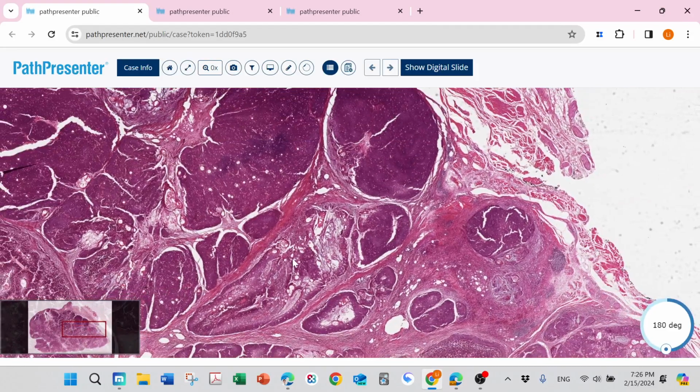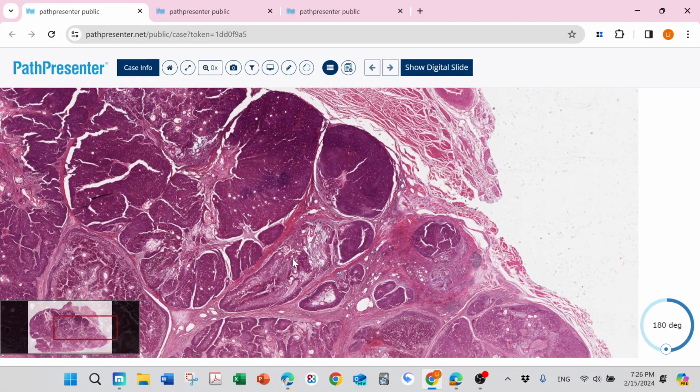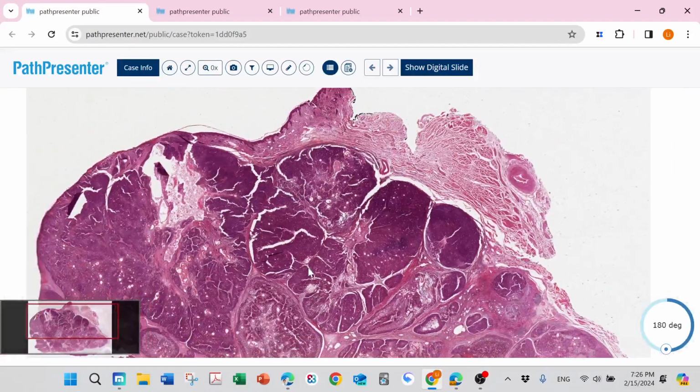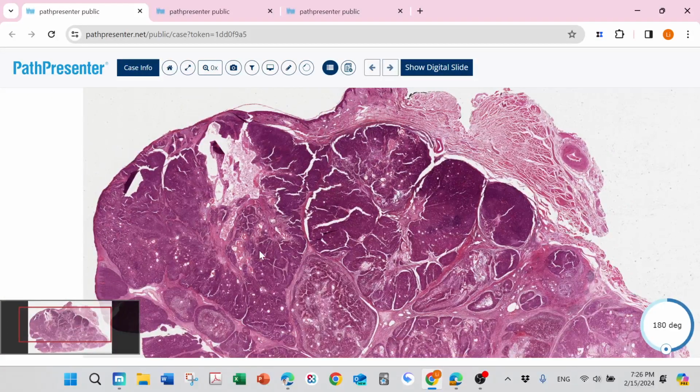And especially if you see sebaceous adenoma, sebaceoma, or sebaceous carcinoma outside of the head and neck area, even as one single lesion, it is highly suspicious for Muir-Torre syndrome. But sebaceous hyperplasia is not related to the Muir-Torre entity. If you think it is sebaceous hyperplasia, that is totally benign, not related to any syndrome.